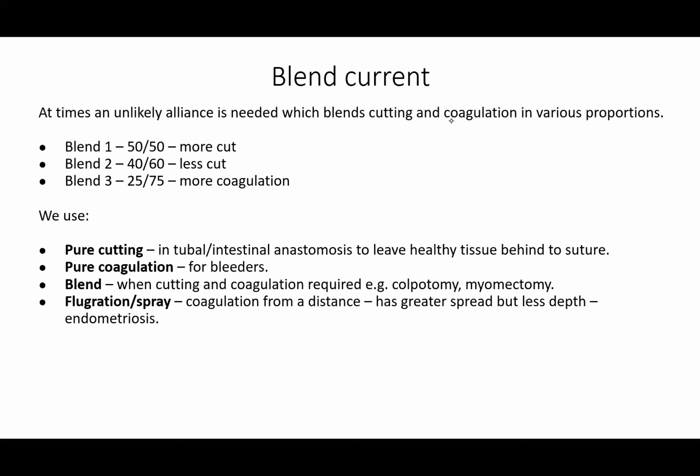Fulguration or spray, you use this for a greater surface that has wide oozes. Coagulation from a distance has a greater spread but less depth. So you are more of securing hemostasis on widespread oozes, like in endometriosis.